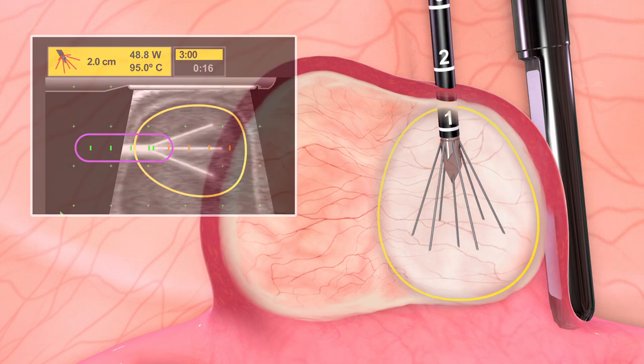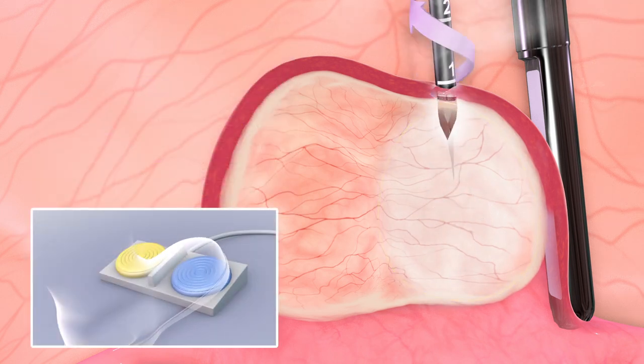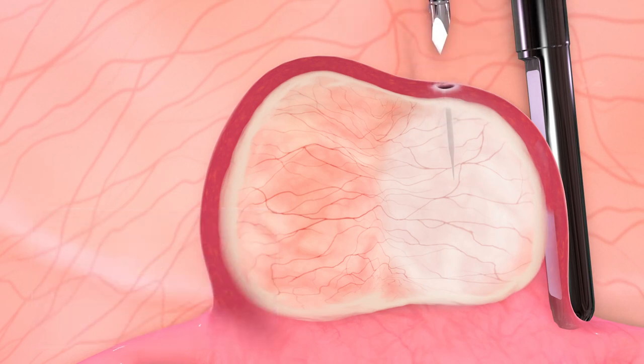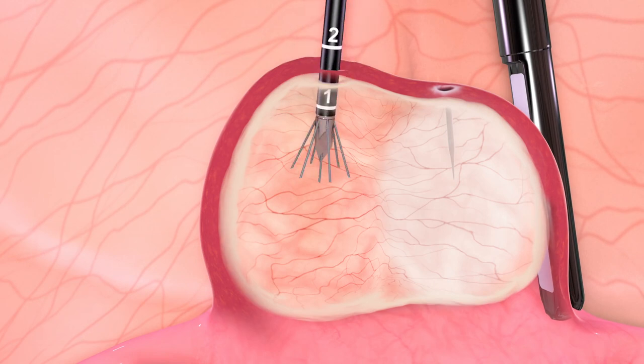After each ablation, the arrays are retracted into the handpiece shaft before the handpiece is withdrawn from the fibroid with coagulation. The steps are repeated with overlapping ablations until all the fibroids are fully treated.